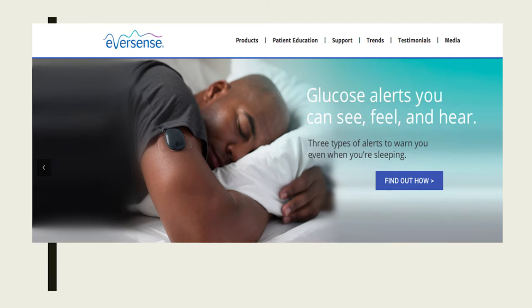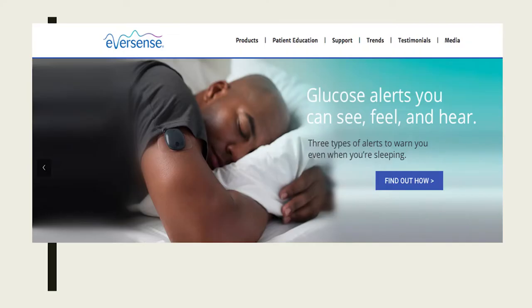The transmitter is secured with a silicone-based gel. It's designed to be removed, and the tape is designed to be removed and reapplied daily. So if patients don't want this visible, they can take it off for a day, 2 days, 3 days, and put it back on. They can take it off for a couple hours. This is totally different in the field of CGMs, in that if you have a device and it gets removed, it's no longer functional, and you either have to call the company about replacing it, or you're out of pocket for the cost. So here, you can at least take the transmitter out. You have the sensor that is implanted and the transmitter that sits over top of it.